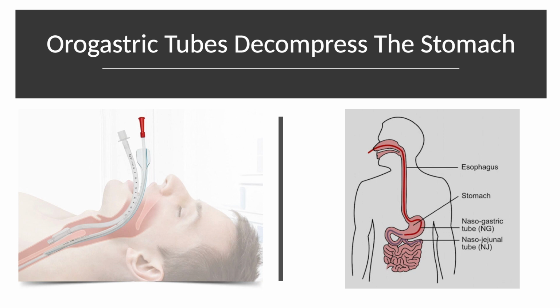So in airways that you're actively having to manage in unconscious patients, if you have time and think about it, using an orogastric tube to suction out the contents of the stomach, whether that's just air or whether that's vomit, is going to give you the added advantage of increasing the volume in the thoracic cavity, where you can ventilate a little bit better and provide yourself some relief, if there's time for that and you have the right equipment.